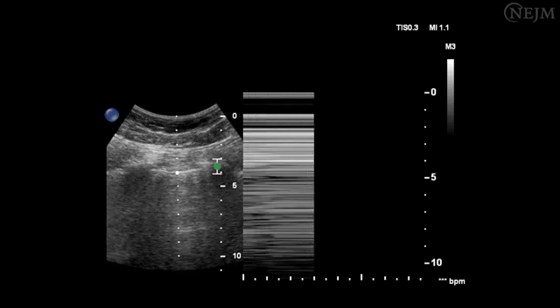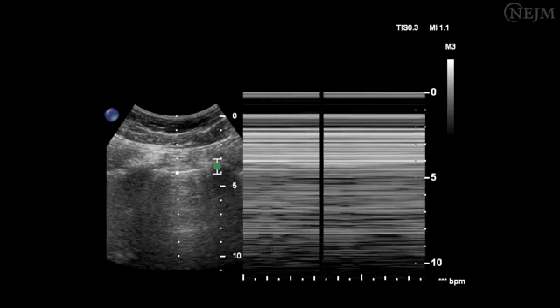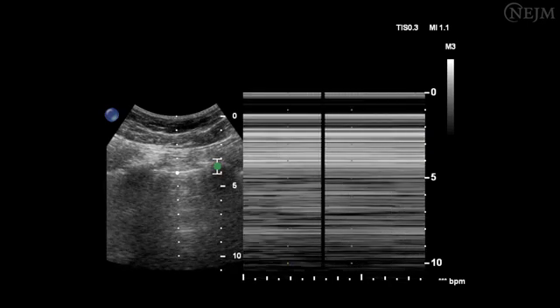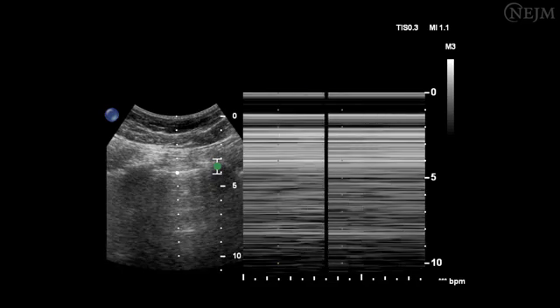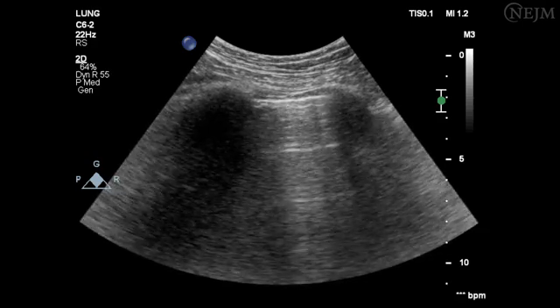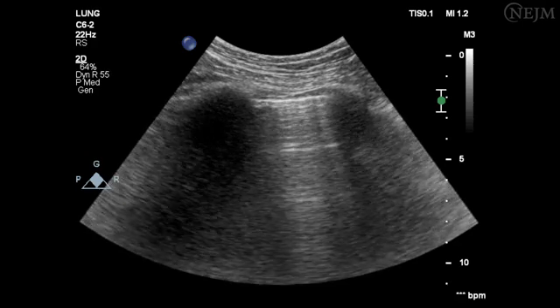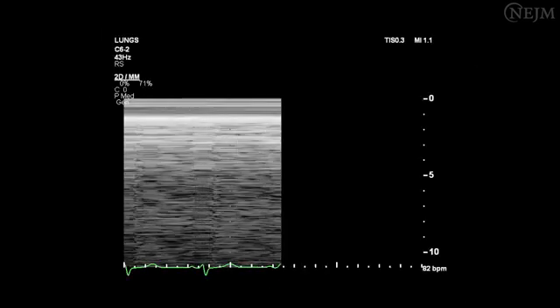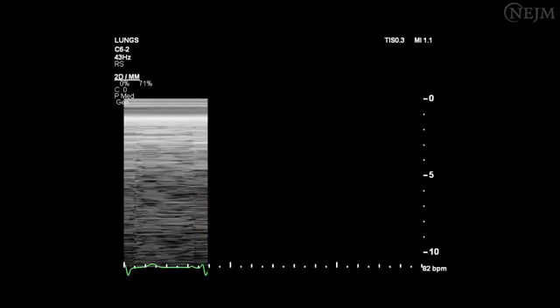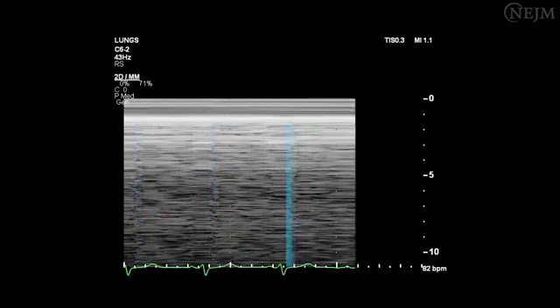When the lung is collapsed as a result of air in the pleural cavity, ultrasound waves are reflected and no movement of the chest structures is visualized. These effects result in a static image known as the barcode or stratosphere sign. In cases of diminished lung sliding with an inconclusive M-mode pattern, it may be useful to investigate the presence of the so-called lung pulse. Lung pulse is a vertical artifact that results from the transmission of heartbeats to the lung. The artifacts reach the pleural line but never cross it.